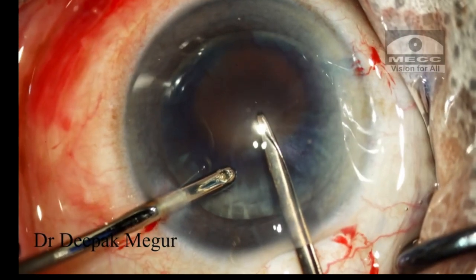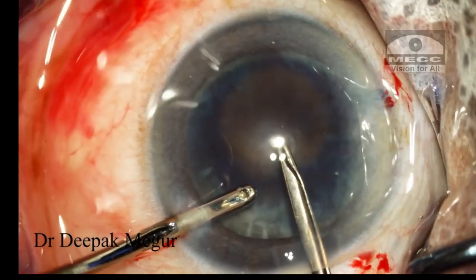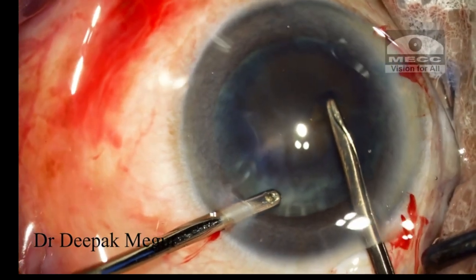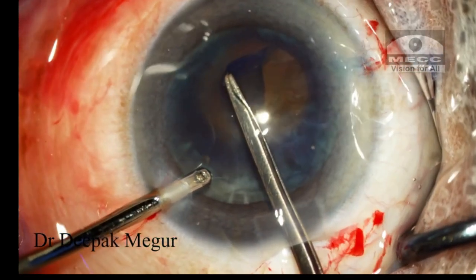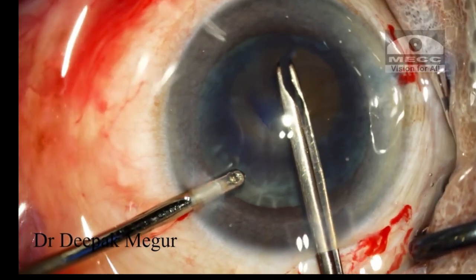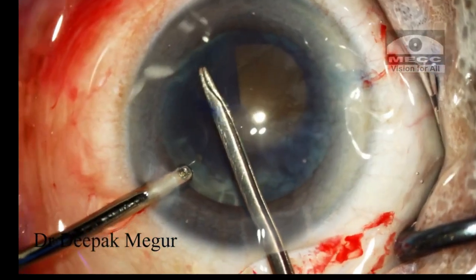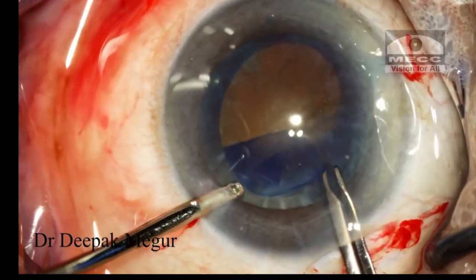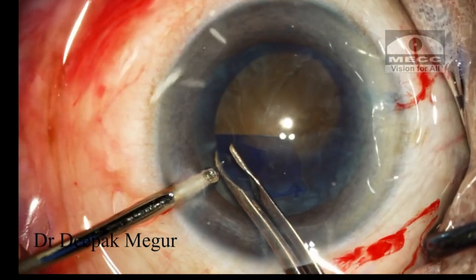Moving on to the rhexis, I'm using forceps to do the rhexis. In such cases where the nucleus is hard and bulky, I aim to perform a rhexis which is not less than 5 millimeter. Having an adequately large rhexis makes life relatively easier during nucleus division and management.